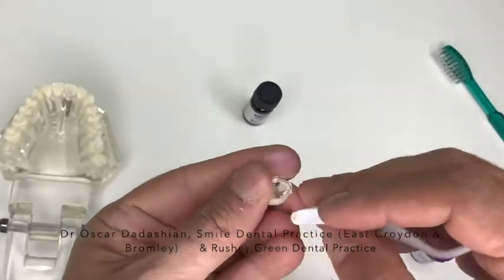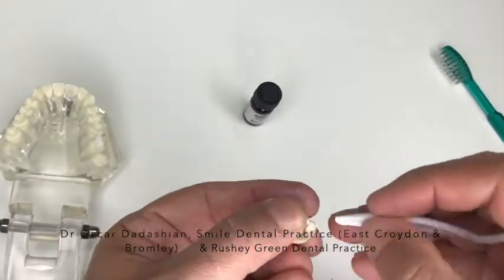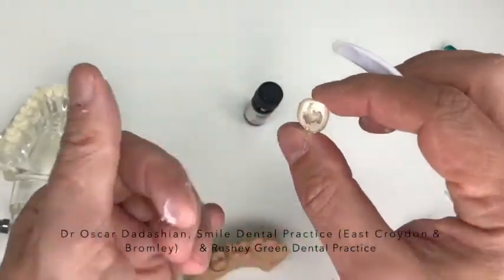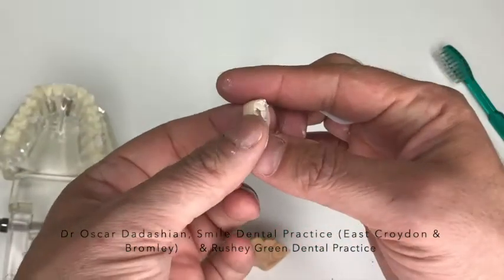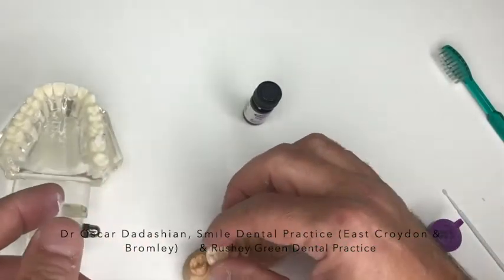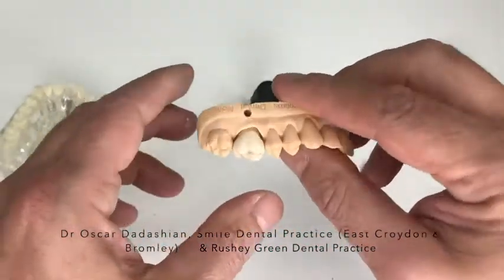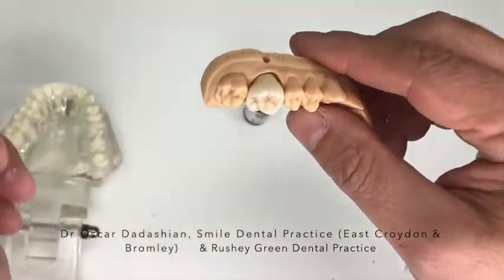Very thin layer. Preferably you want to make it as even as possible. So as you can see, I haven't necessarily filled the inside of it, but I've done the edges, the side of it, because that's the most important part. And then I place it on the tooth. When you place it on the tooth, it's going to feel raised. It hasn't gone in because the material is there. This material is going to function as a space filler.